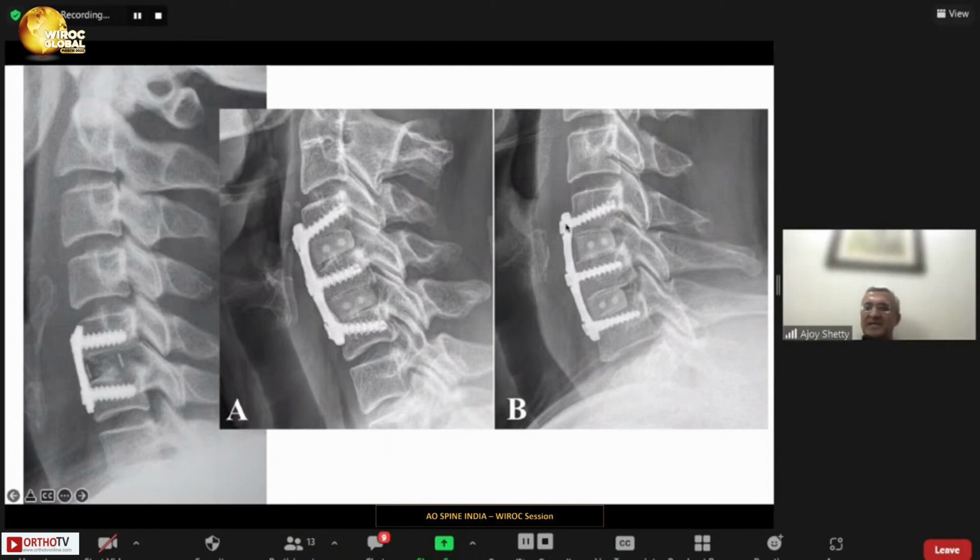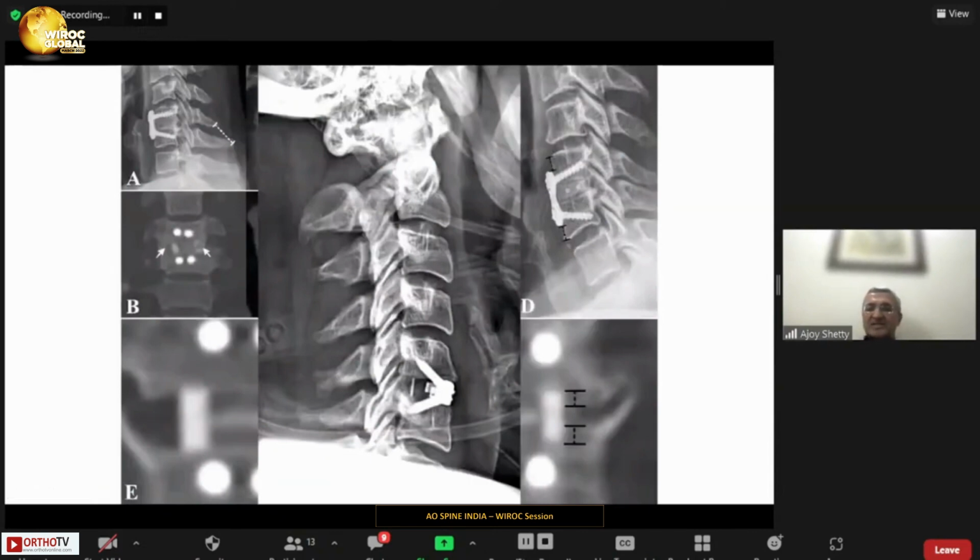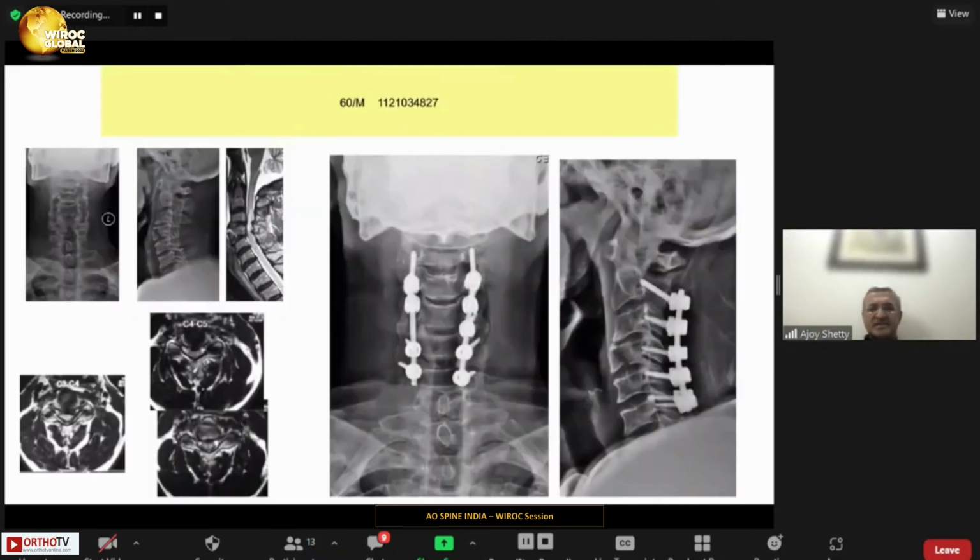And if your plate extends like this, it can cause ossification, especially in other scenarios. And if your plate is coming up to here, a screw is coming up to here, it might interfere with the nutrition of the disc above. And that's the reason why we have low profile plates. The chance of causing adjacent segment issues is relatively lesser, and the chance of dysphagia is lesser.